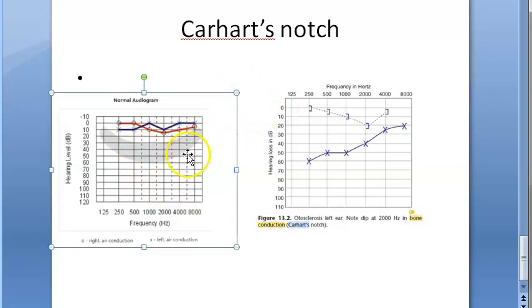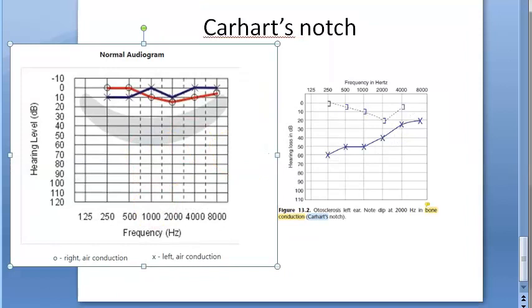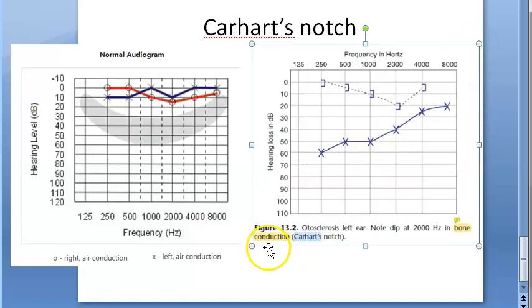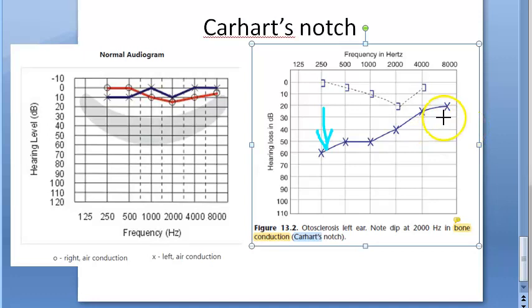Look at this — this is a normal audiogram. Focus on the blue line because blue is the left. Let's say this is the air conduction — bone conduction and air conduction are overlapping. Actually, bone conduction will be less than air conduction, but in the audiogram they adjust the decibels so they come at the same level. Now what has happened in otosclerosis? The air conduction has completely decreased.